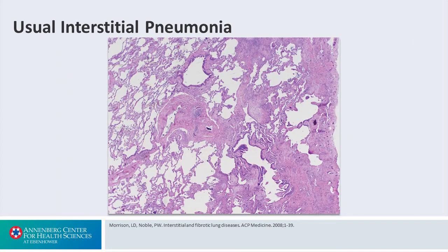Now that term is important. All it means is the usual or most common type of scar. When you look at this slide, it really says everything you need to see. What you notice first is a juxtaposition of normal lung on the left side of the slide versus abnormal fibrotic tissue on the right.